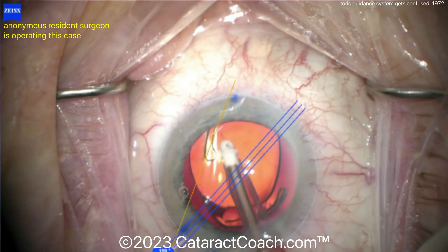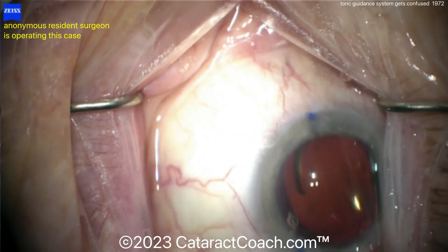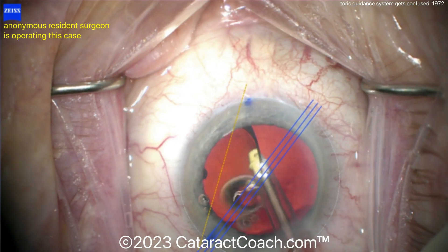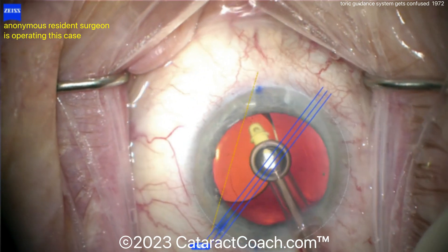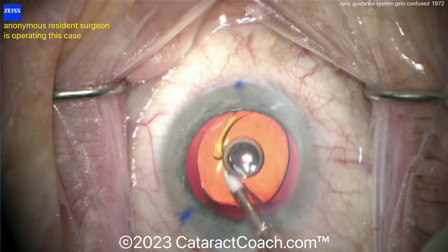Look carefully here. You can see the machine is reading the paracentesis and the nasal mark as the 180, and that's not the 180. Therefore it's showing you those three blue lines of where the intended axis is, and those are not correct. So it's important to figure this out ahead of time and say, wait a minute — let me use some common sense here.